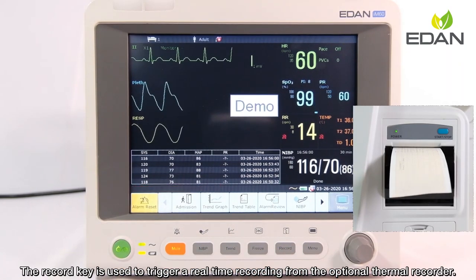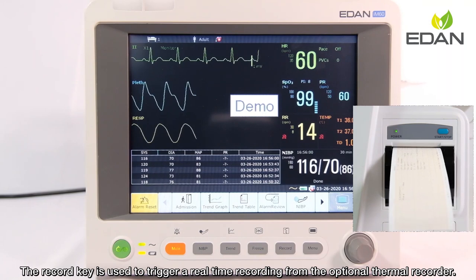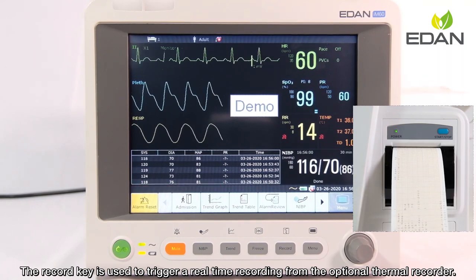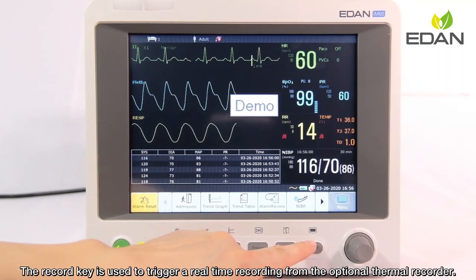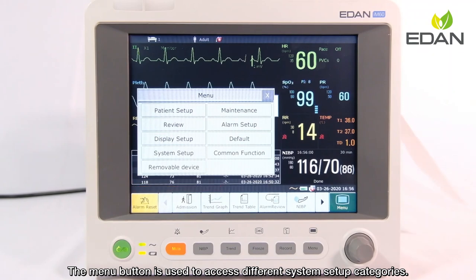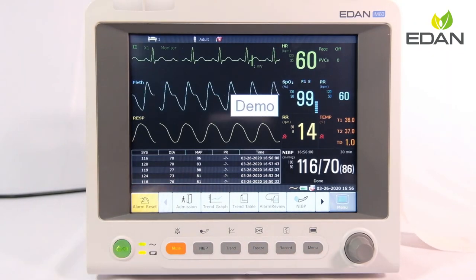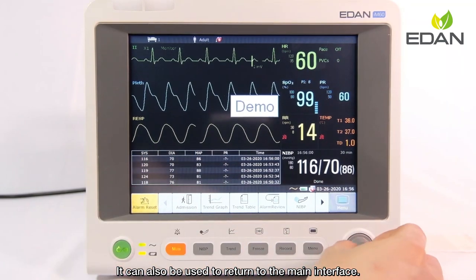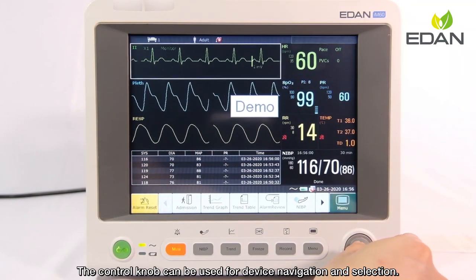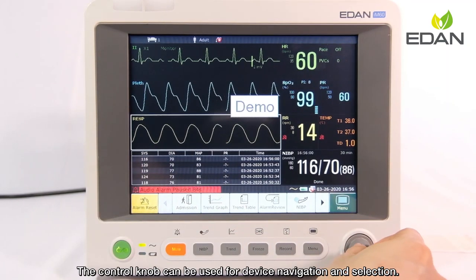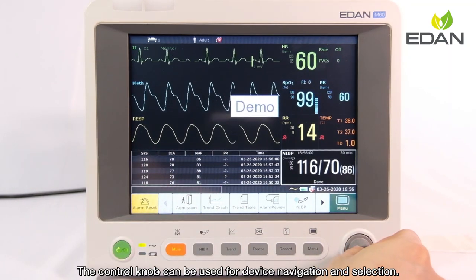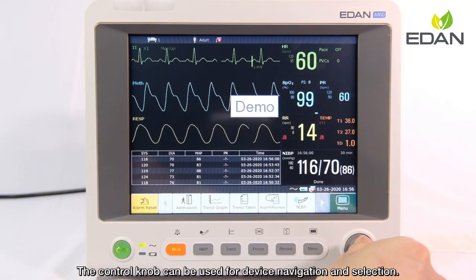The record key is used to trigger a real-time recording from the optional thermal recorder. The menu button is used to access different system setup categories and can also be used to return to the main interface. The control knob can be used for device navigation and selection.